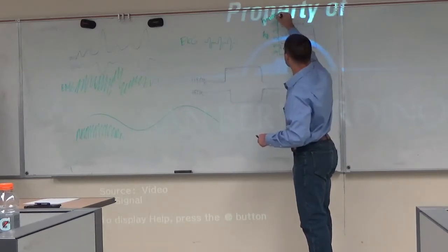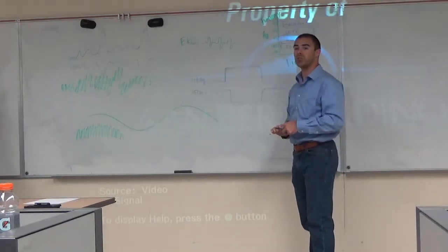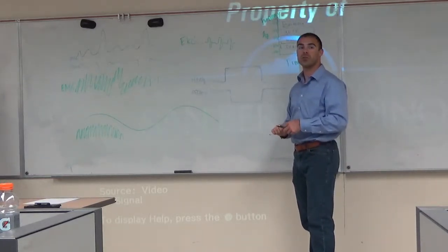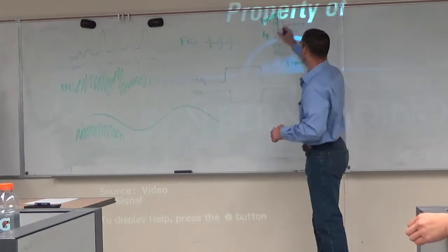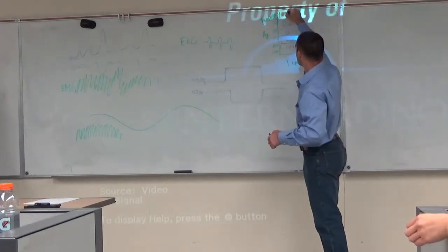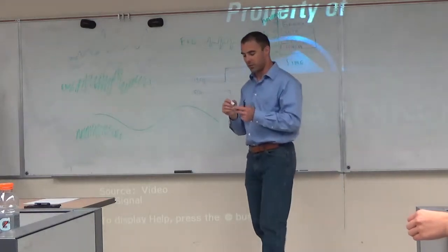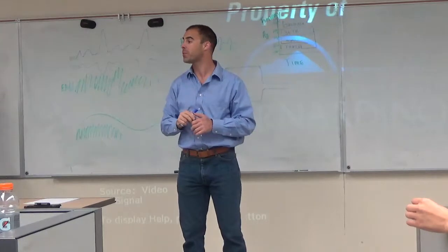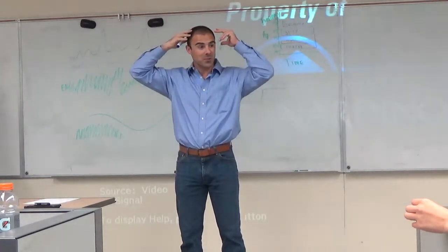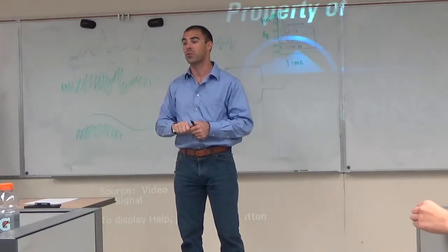And up at about 60 hertz, you're going to have a different type of artifact called line noise. Anybody know what line noise is? No electrical engineers in the house? So up here at 60, you're going to have a certain frequency of activity that's very high, and that is basically the frequency of your lights in the room. When we record brain activity in humans, our brains never produce activity that's 60 hertz for the most part.